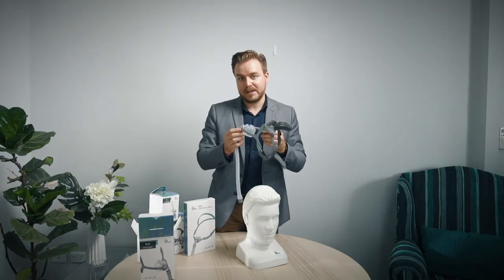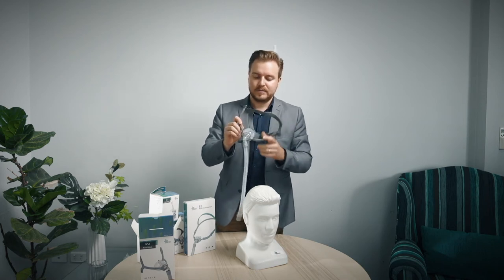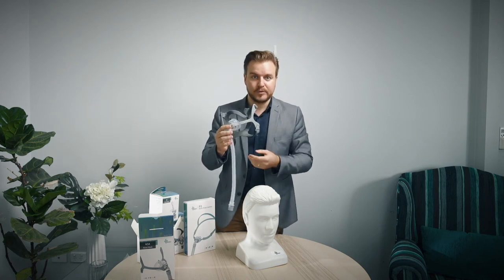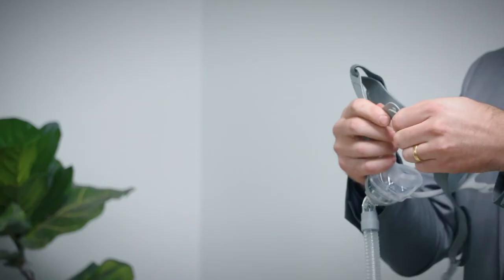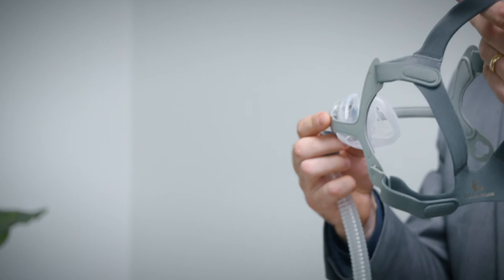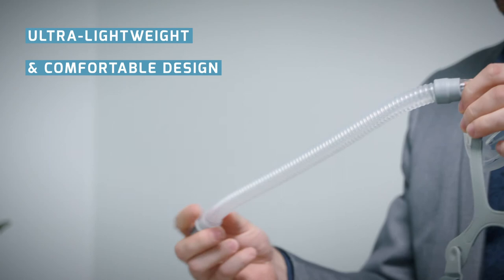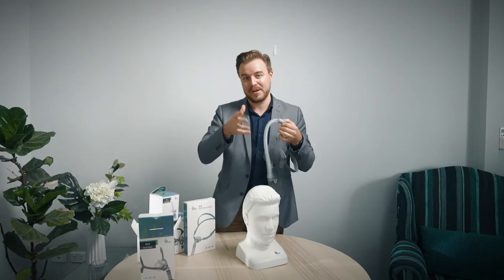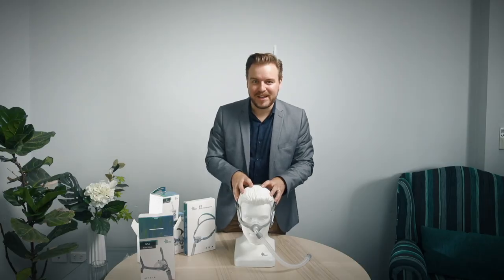The BMC N5A nasal mask is one of the most popular masks on the market. You've got a clear sight of vision when using the mask so you can wear it with glasses or use your phone before you go to bed. You've got easy-release clips, four points of adjustment on the headgear, soft cushion material on the inside, and a short tube which gives you a little bit of extra length so you can move around more in bed. This is the BMC N5A nasal mask.